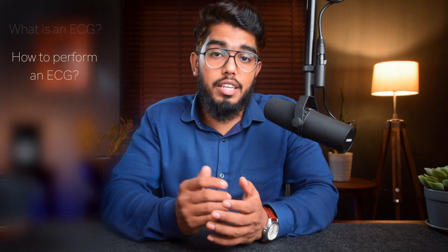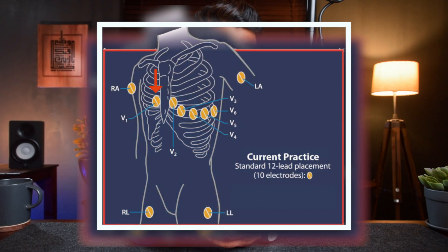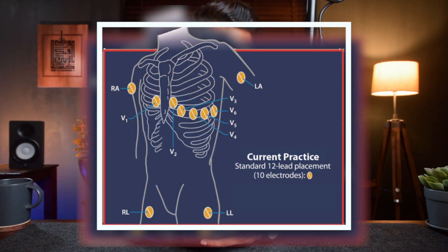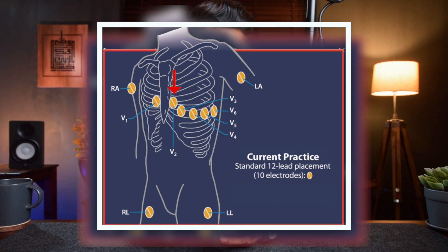To perform an ECG, electrodes are placed on the skin of the chest, arms, and legs, and we have to make sure they're placed at the correct positions. V1 is placed at the 4th intercostal space at the right sternal border. V2 is placed at the 4th intercostal space at the left sternal border.